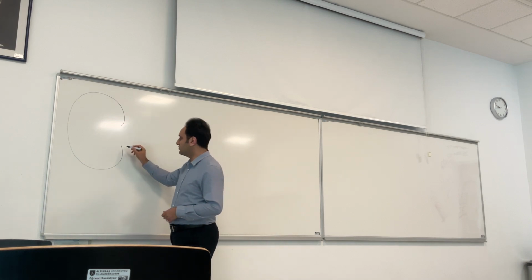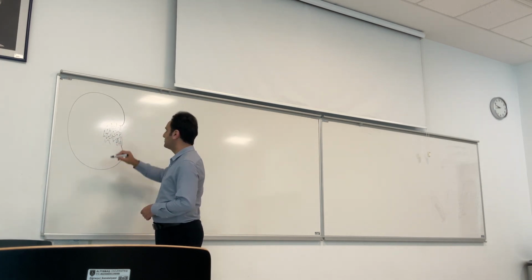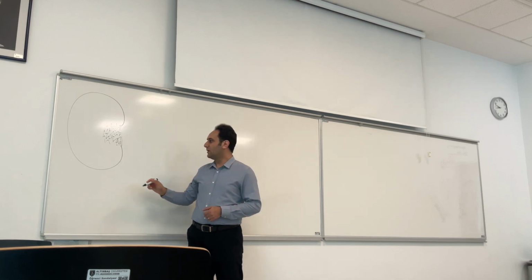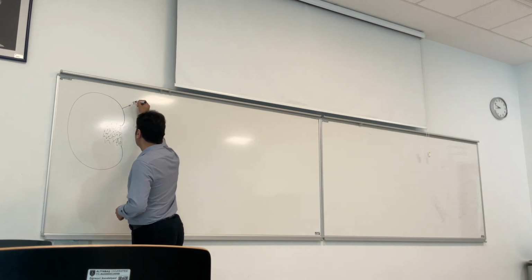This connective tissue forms a connective tissue structure in the middle side of the testis. This connective tissue on the outer side is known as the tunica albuginea, and this part is known as the mediastinum testis.